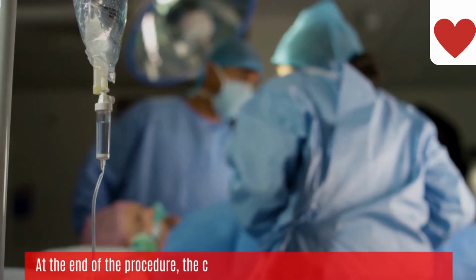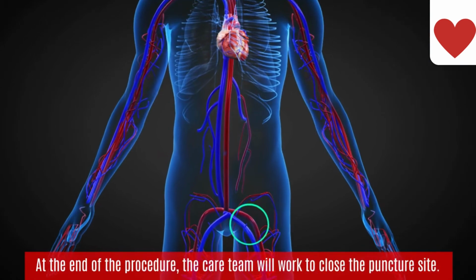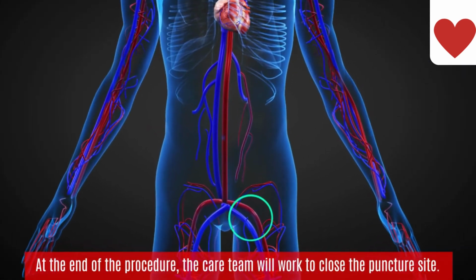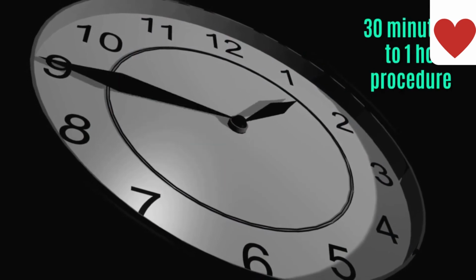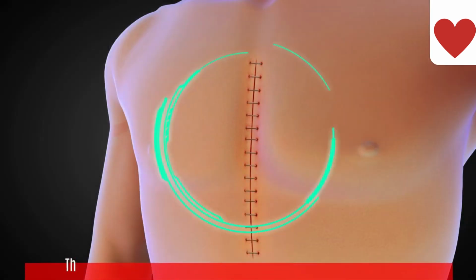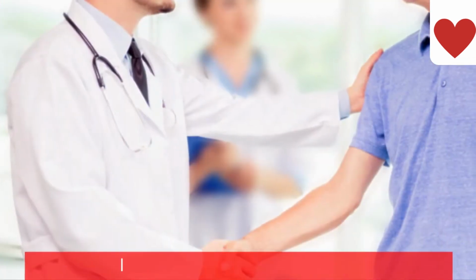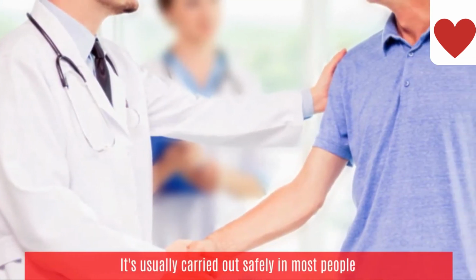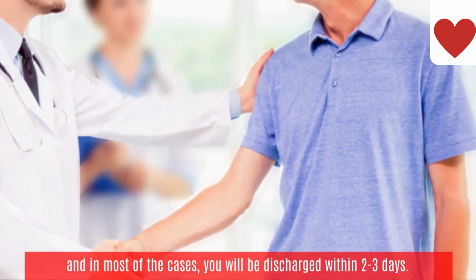At the end of the procedure, the care team will work to close the puncture site where the catheter was inserted. This procedure lasts for 30 minutes to 1 hour. As the procedure doesn't involve making major incisions in the body, it's usually carried out safely in most people, and in most of the cases, you will be discharged within 2 to 3 days.